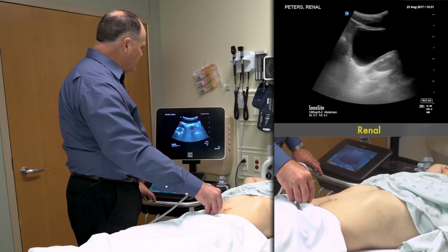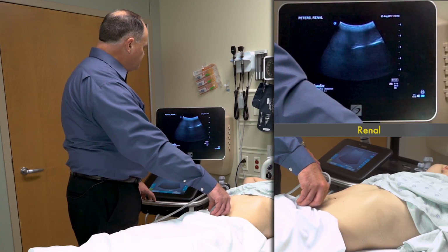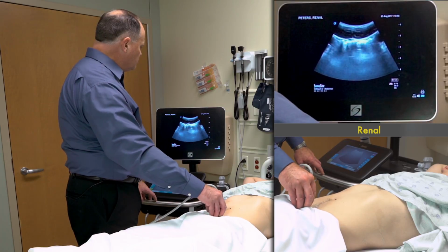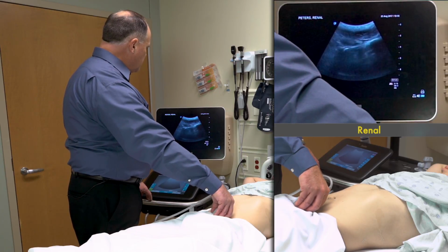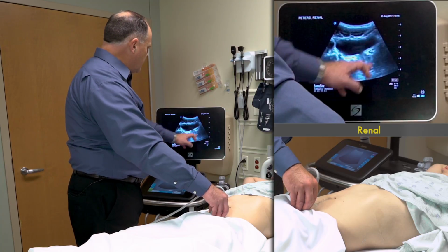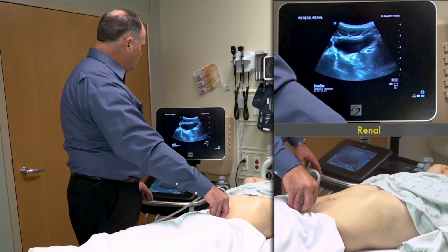I'll then turn to the short axis, and I'll image the bladder in short axis, fanning from caudad to cranial. And again, you can see that the prostate is here in the far field, and I don't see any shadowing stones entering the posterior aspect as I slowly fan through. Now when the bladder is more full, sometimes they'd be easier to see.